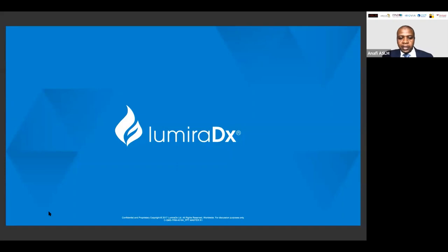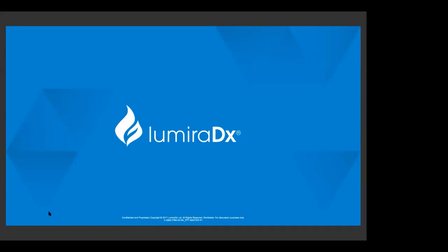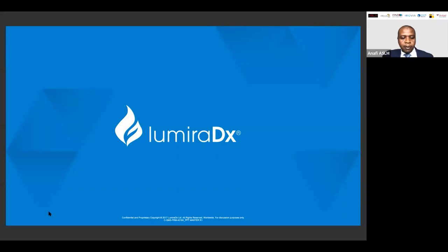Okay, thank you. Maybe I may just add, do you have an estimate of how many tests you can run, or how long it can stay on battery? It'll obviously depend upon each situation, but we can run 20 of these antigen tests on one complete battery charge. Okay, thank you. Questions keep on coming. The one I'm touching on here, as a representative of those, Devi has also asked about battery life. I think that has just been responded to.